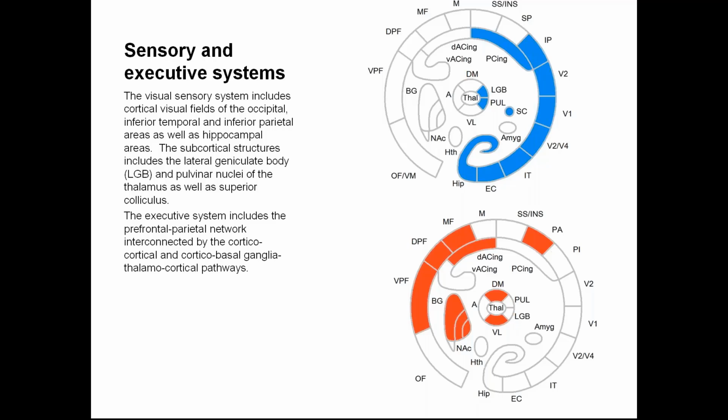And to answer this question, you actually have to study event-related potentials, which is completely different from the spontaneous EEG. It's evoked EEG, I mean, the potentials evoked by certain stimuli in certain task conditions.